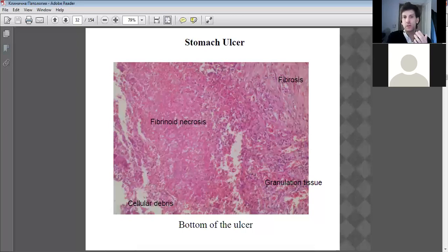Before, when we saw the last slide, we saw these little dark bits, but now it's magnified, we can see them a bit more clearly. So with necrosis, you're getting what's called the atrophy of the cells, they're decreasing in size, and you're getting more space forming as a result. Lots of cellular debris as well due to the death of the cells. Eventually, this whole area is going to slough off, it's going to break away, and into the stomach space, if you like. Yeah, nice, that's a very good slide.